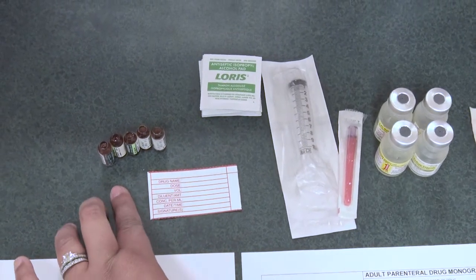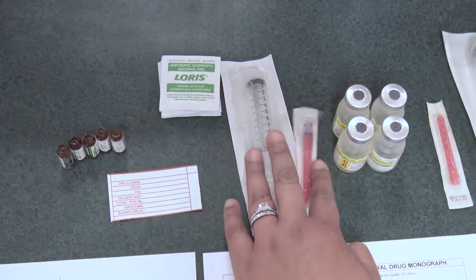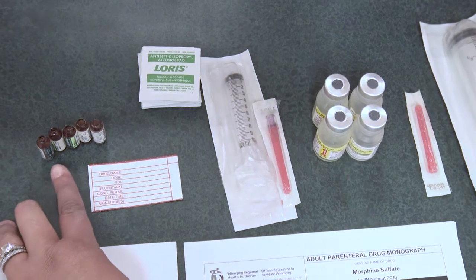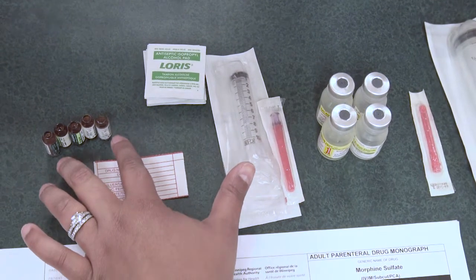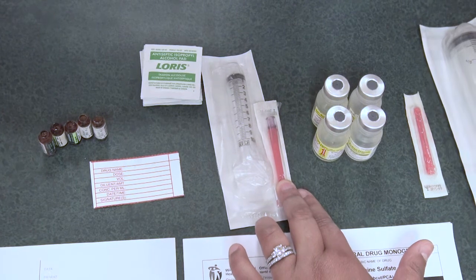I have my morphine ampules, a label, some alcohol swabs, a syringe, and a filter needle. The reason I have a separate syringe is because when I'm drawing up my medication, I want to be as accurate as I can be. And remember, when you're using an ampule, you always want to use a filter needle.